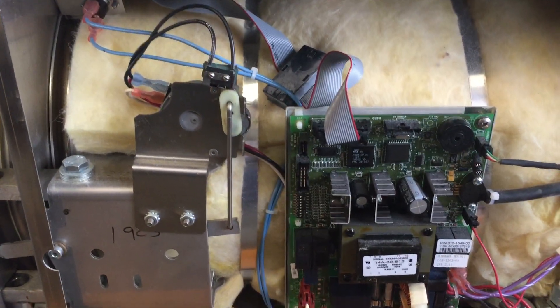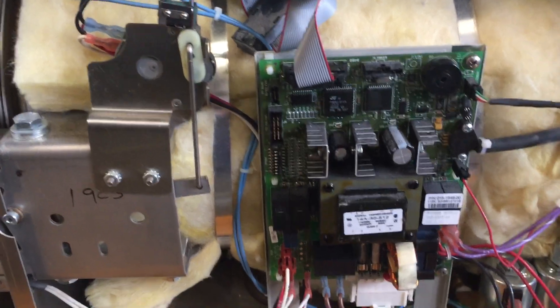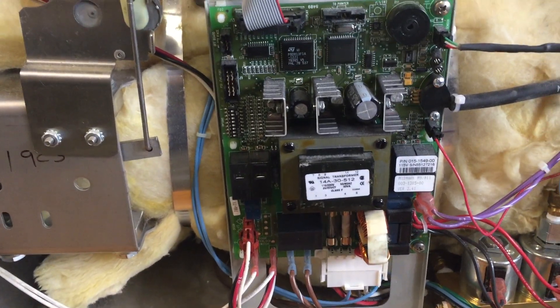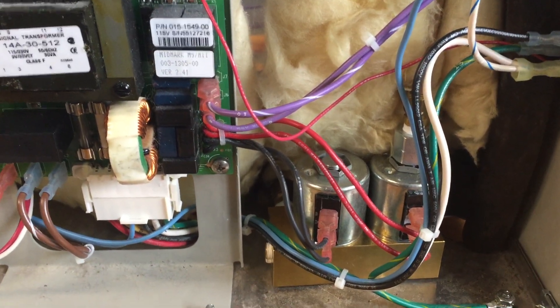You need to open the right side. Most parts are on the right side. You will see the circuit board, the control board, and also you will see the solenoid valves. Most problems happen here.